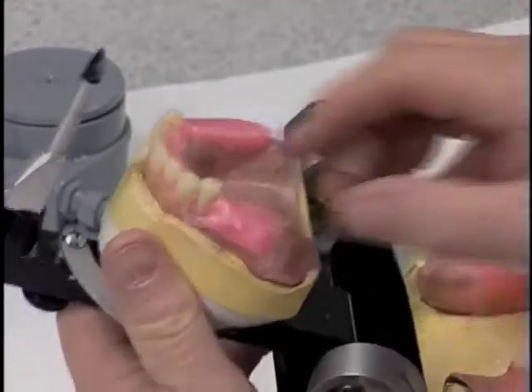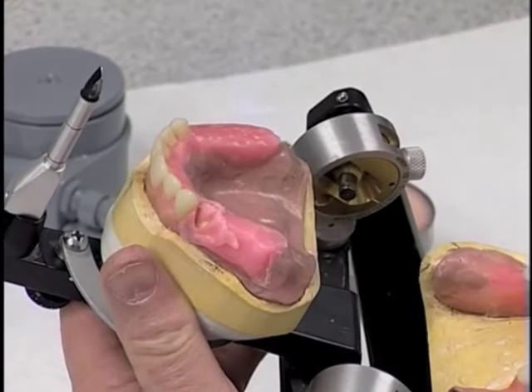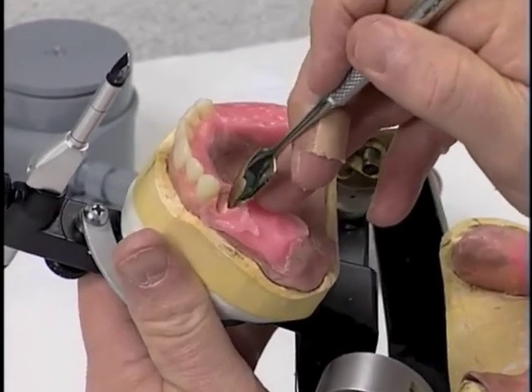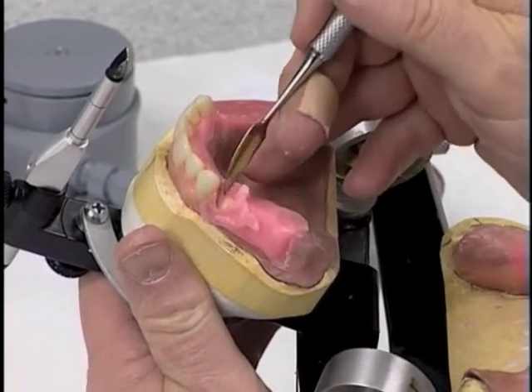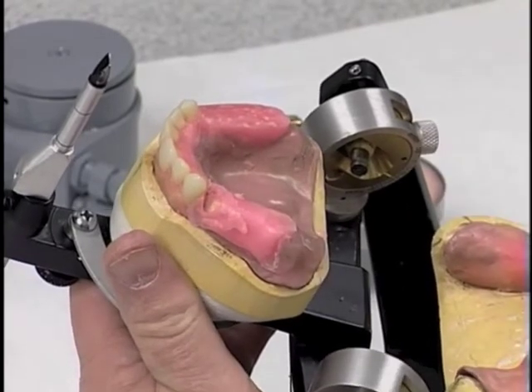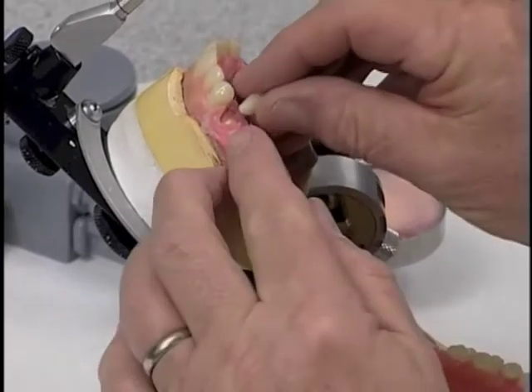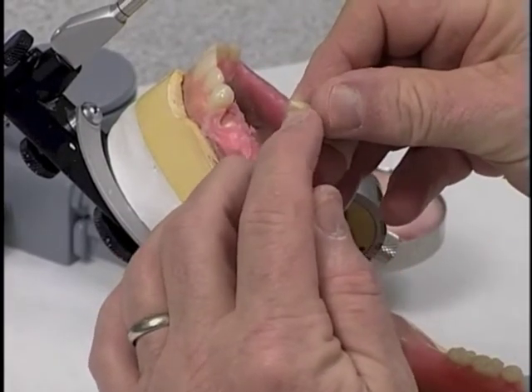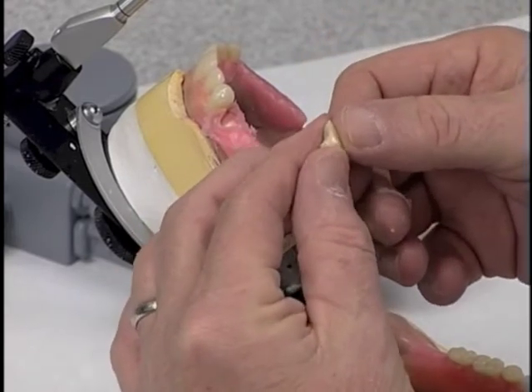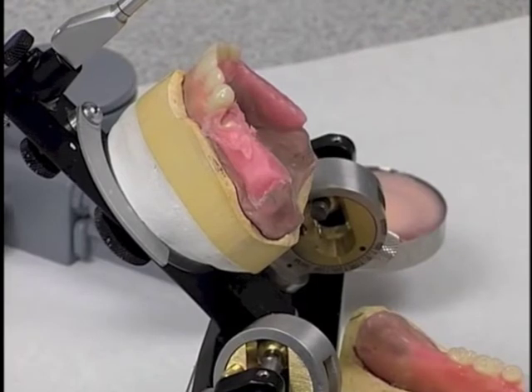And it appears as though we may still have a little interference, and we do. We can see right there that that tooth still will not go in place well enough because of interference. So what do we do then? We've cut a window. We can't cut on the cast to get it in there, so we're going to trim the tooth down in the area, which would be right in here. We're going to take a handpiece, a slow-speed handpiece, and an acrylic burr, and we're going to trim the ridge lap of the tooth enough so that it will accommodate it.